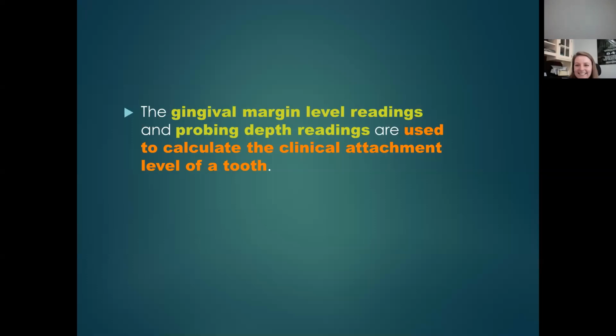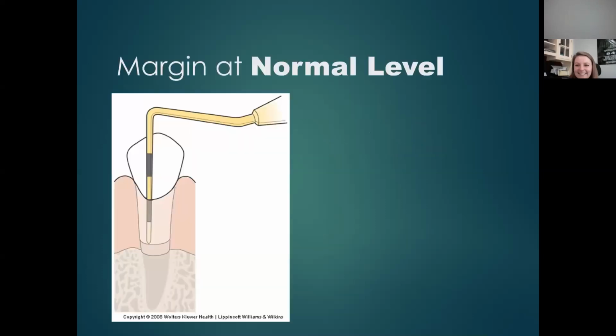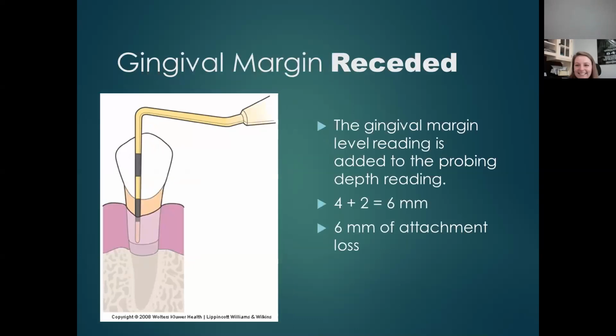One of the students who took their boards said their periodontal probing did not have recession on the chart like ours does, like the Dentrix has. They had to go into the pictures and other things to find where the recession was and then calculate the CAL. So they oftentimes don't make it easy on you either. Okay, normal level, gingival margin, you don't have any calculations to do.